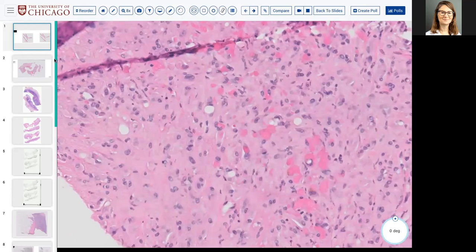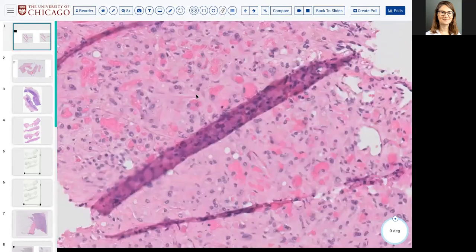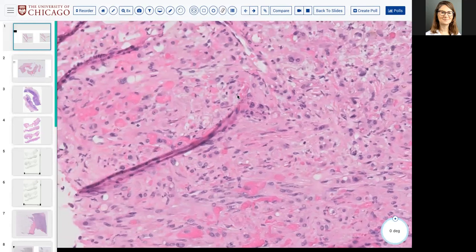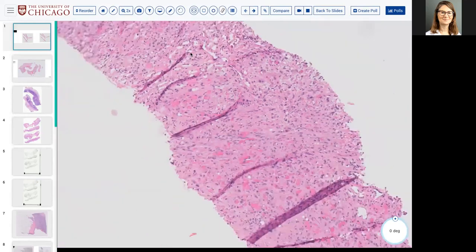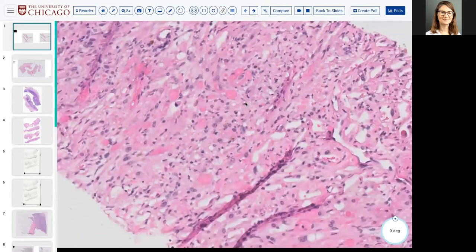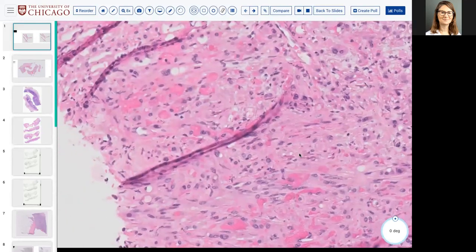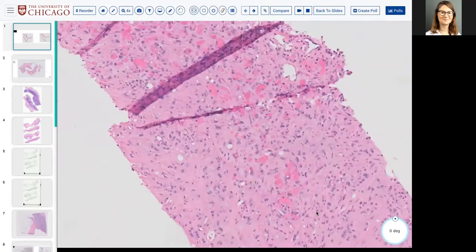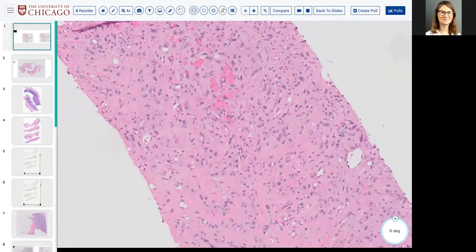As you may have guessed based on the subsequent slides, we're going to be seeing a lot of tumors with an epithelioid morphology, many of which characteristically or somewhat can express keratins. So don't ever let that fool you into ignoring the fact that this could be of mesenchymal origin. Exactly. And so then when you do your vascular markers, like you said, what are the cytoplasmic vascular markers?